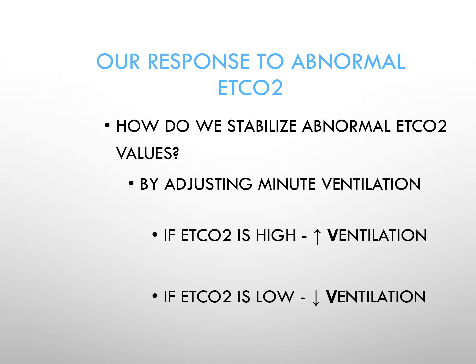So if they're at the lower end, at about 6 mLs, 5 mLs per kg of tidal volume, and their plateau pressures and driving pressures are okay. When we say that, driving pressure should be less than 15, plateau pressure should be equal to or less than 30.